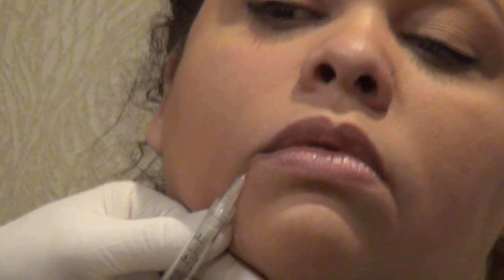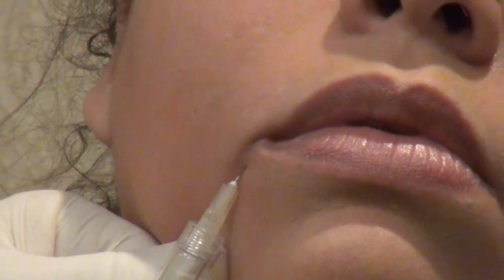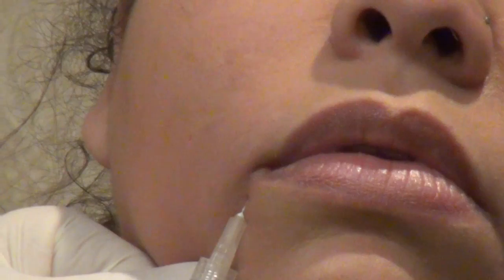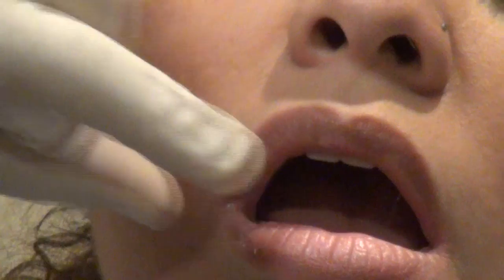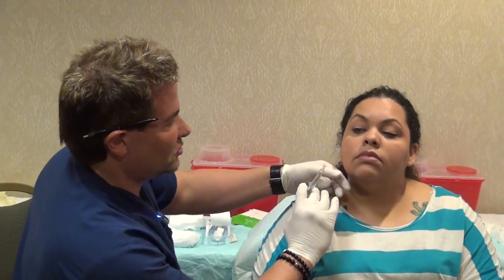Just a little stick right there. Nice and slow, take your time. The fanning technique is where you come in like this and just turn the syringe, and as you pull out — there we go. Open your mouth for a second. Perfect. Now you can see a little bit already — I only did about 0.1 cc. You can already see the plump. Don't be too aggressive — just a little bit. People want a natural look, and that's the better result.